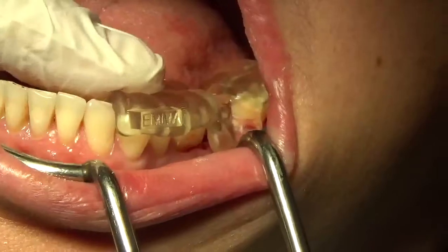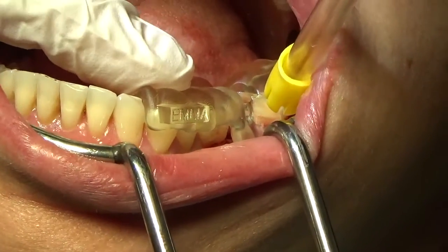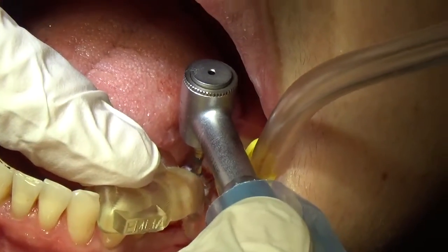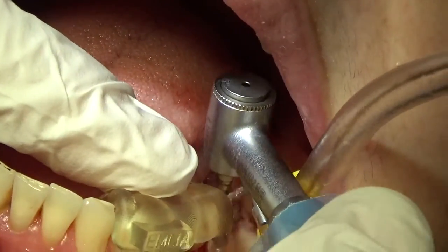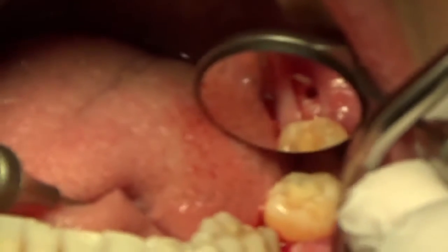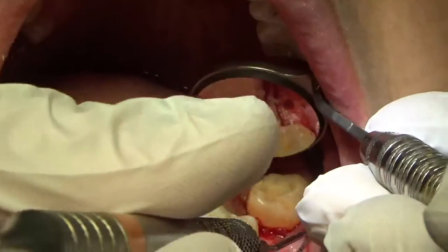Yeah, these guides tend to move just a little bit unless they're actually tacked in. So usually what I'll do, I'll either hold a portion of it or have the assistant hold a portion of it. Line it up, make sure we're passive, and then it just goes to depth. There's an in and out motion here. Great. It's hard to see. That's good. I can see perfect. So what is that showing me? That shows me that it's kind of where we planned it. Fairly buccal right there. We want 2 millimeters. Yeah, fairly buccal. What's on this guy?